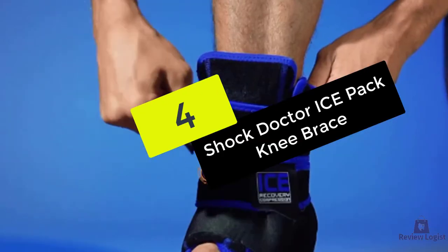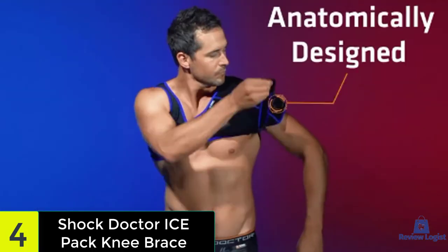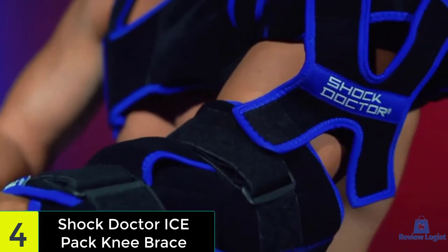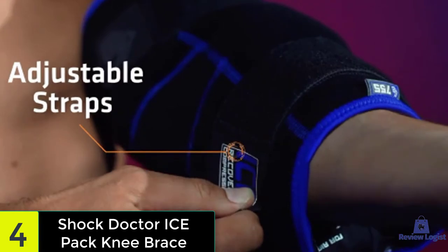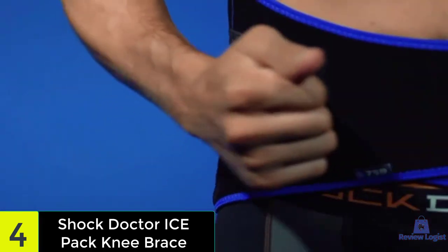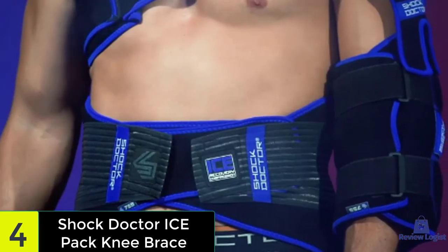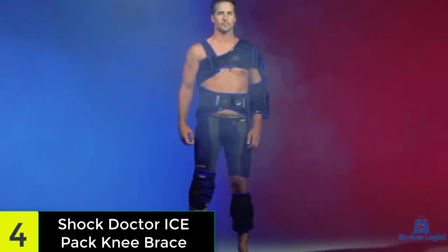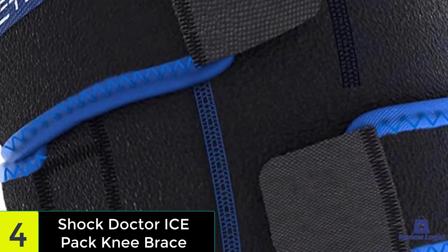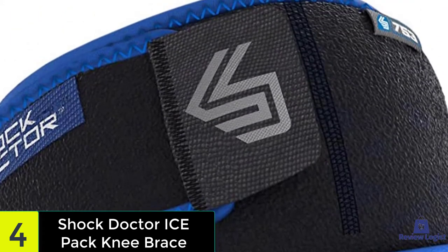At number four, we have the knee brace by Shock Doctor, which offers neoprene fabric that is soft to the touch yet durable and washable. What sets the Shock Doctor Ice Recovery apart is the frozen gel packs that slip inside the brace, reducing inflammation and aiding in the healing process. These packs are reusable and extremely easy to slide in and out of their designated pockets. This brace doesn't offer a ton of patellar support but it still offers plenty of ACL support and compression to ensure overall knee stability, along with trademarked straps that help it fit each individual perfectly.